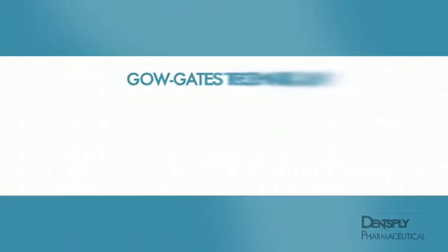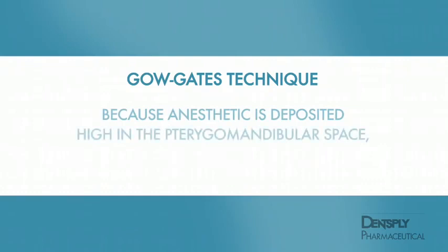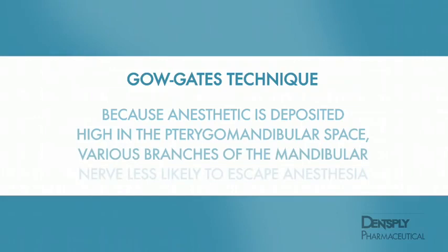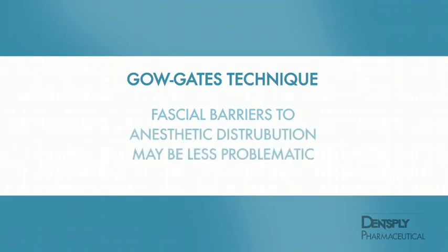When properly performed, the Gow-Gates block offers some advantages over the standard inferior alveolar nerve block. Because the anesthetic is deposited high up within the pterygomandibular space, it is less likely that various branches of the mandibular nerve, which may provide anomalous innervation of the mandibular teeth, will escape being bathed in anesthetic solution. Also, fascial barriers to anesthetic distribution may be less problematic than with the standard injection.